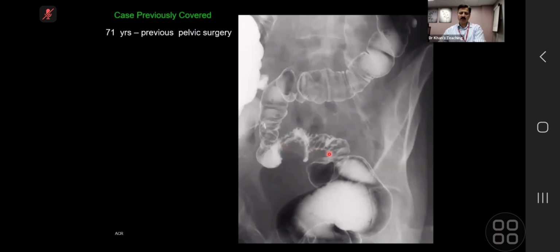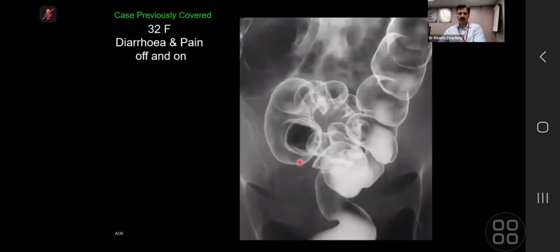Metastases are sitting at the rectosigmoid junction here, and this is ovarian metastasis. When something sits on the serosal surface, two things are important for the exam. One is metastasis, the second thing is endometriosis. Here you can see it is causing some indentation and the lumen is narrowed. Because of the desmoplastic reaction, folds of barium are going towards the soft tissue mass, and the mucosal folds might be sort of fixed there. We call this the striped colon sign. So metastasis sitting here, metastasis sitting here.